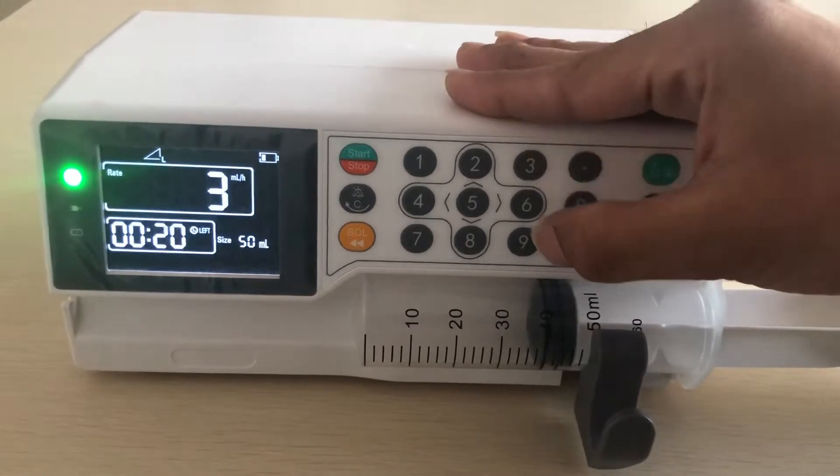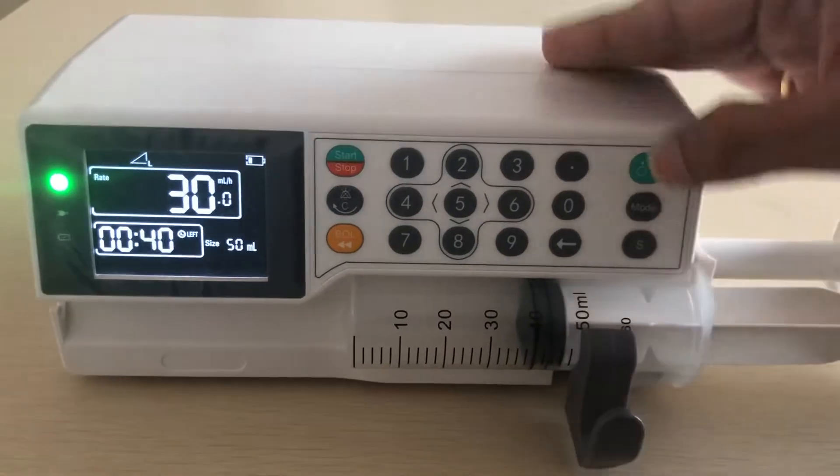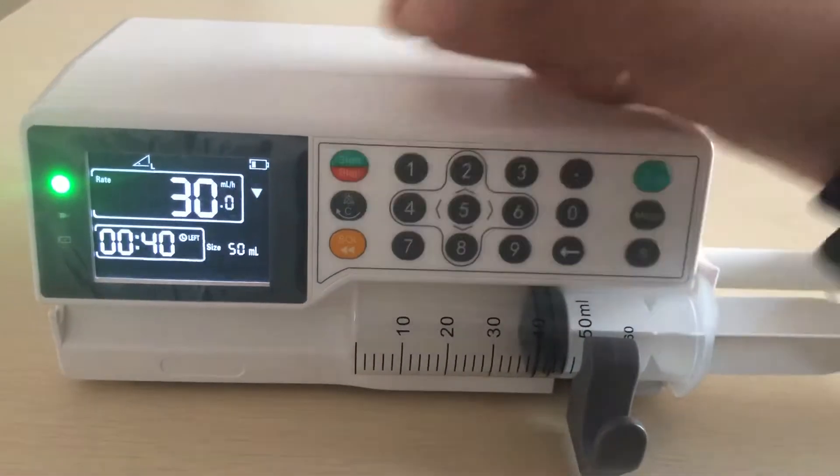The rate in ml per hour you can change here — 30. Then start. Select: this is the select option, and this is the start option.